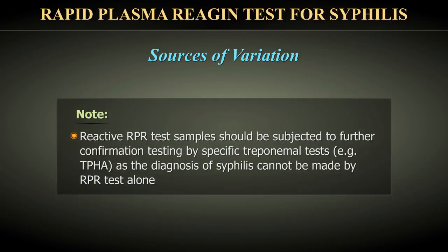Note: reactive RPR test samples should be subjected to further confirmation testing by specific treponemal tests, for example, TPHA, as the diagnosis of syphilis cannot be made by RPR test alone.